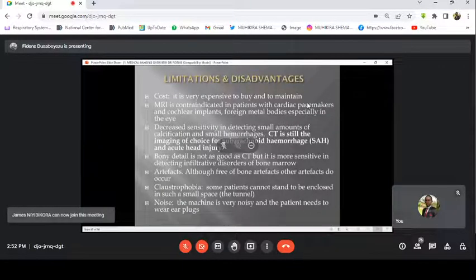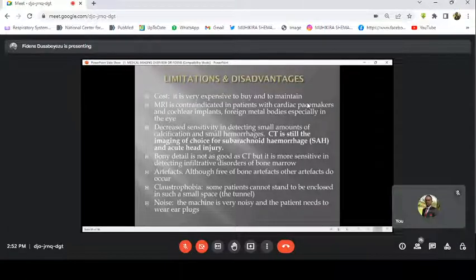Another one, what I have experienced myself, not as me as patient, but from patients, is claustrophobia. People, they fear to go into MRI machine. Many people refuse to do the scan because of claustrophobia. Because it is a very small machine where you go in and spend some time, 30 minutes in. People, they fear it. They fear completely, say, no, really, let me go and die. I will not do this MRI.